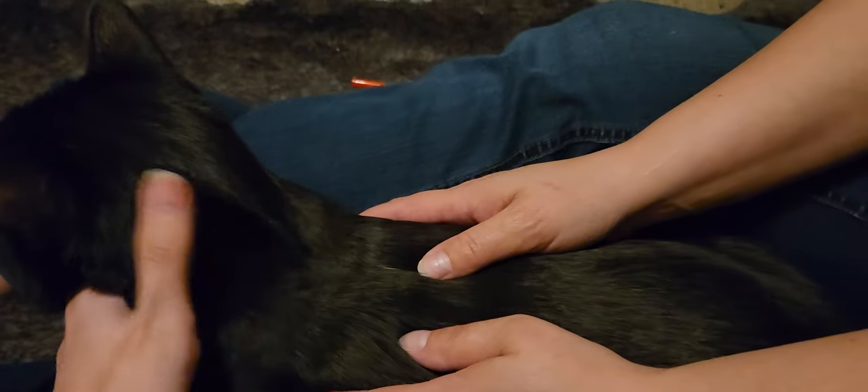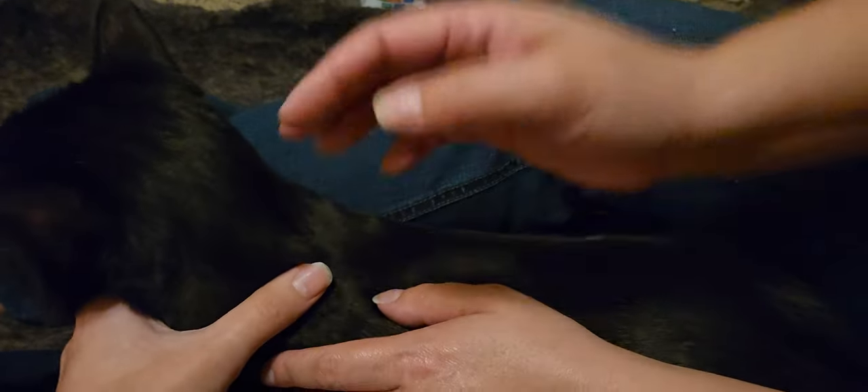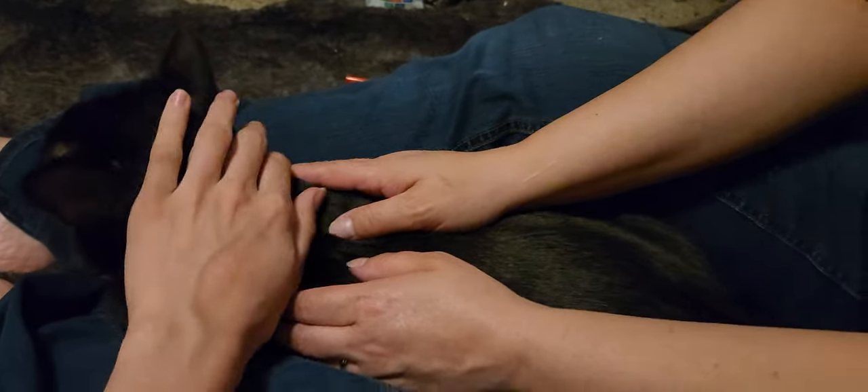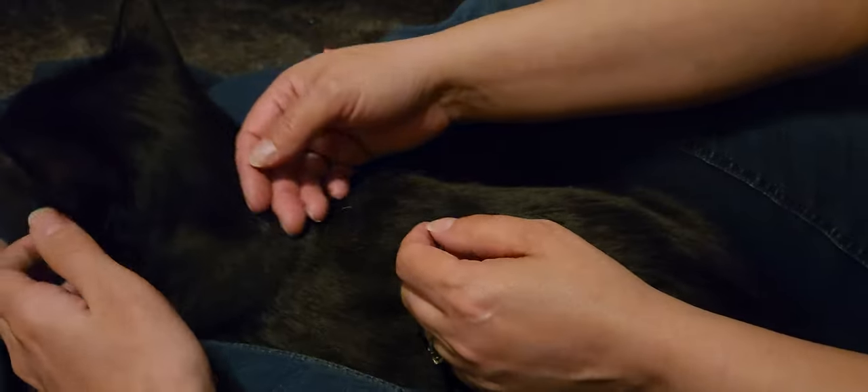I like to hold Max like this — it helps me keep control over him so he doesn't run away. I like to pet his cheeks to keep him calm.